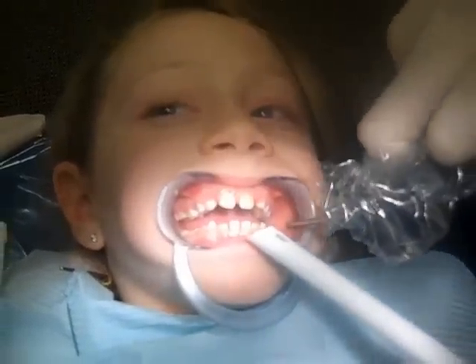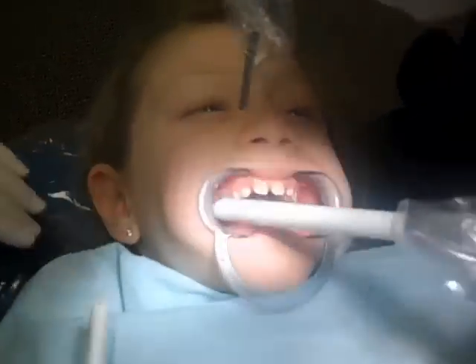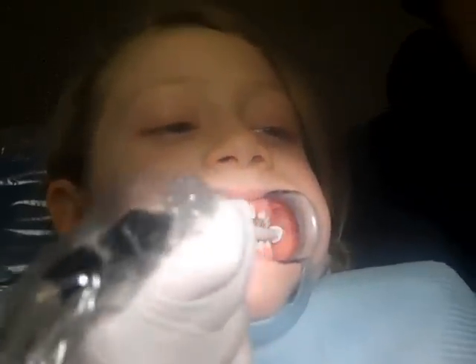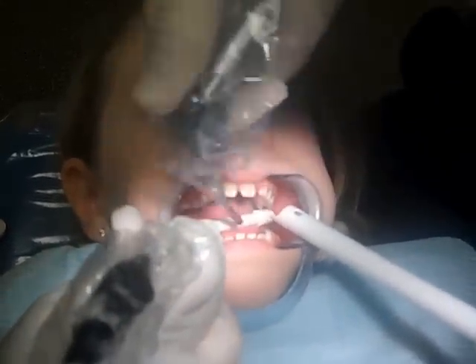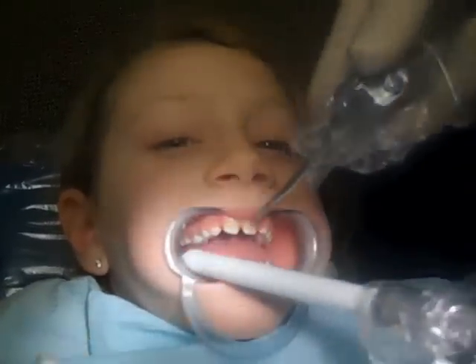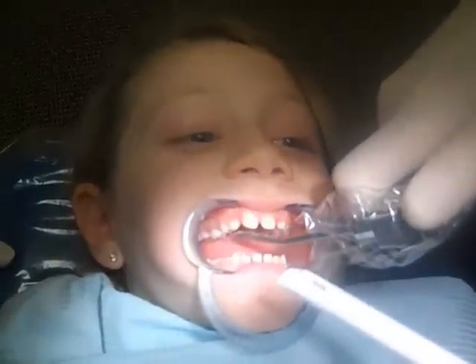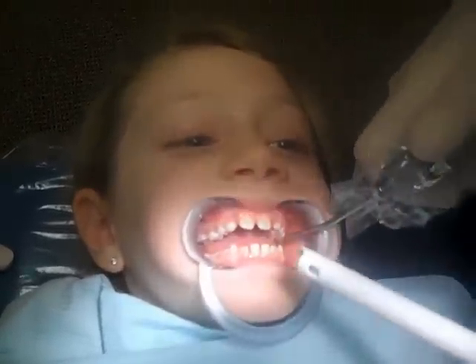Now, sweetie, what I want you to do is open real big again — good job. We've got to make sure when we do this procedure that all the teeth are very dry. That's the most difficult part. Logan would tell you that herself, but she's occupied right now — she has a lot to say, but she can't right now. So we're going to interview her after.